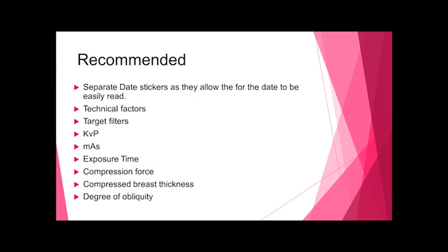Separate date stickers if it's printed. Some digital facilities still print. I know it's not economically viable, but I do see some facilities still print their images, even in digital.